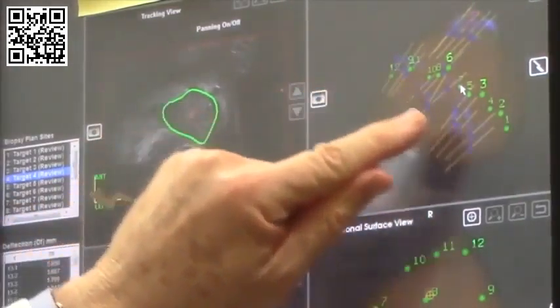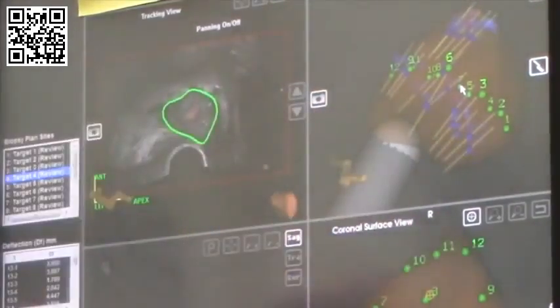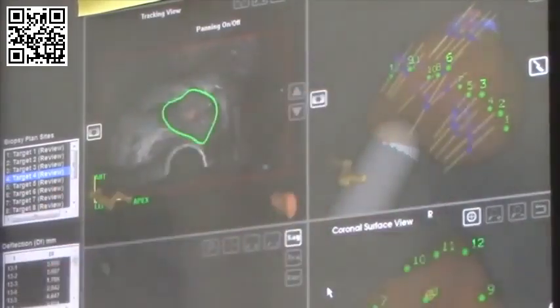These cores here, each tan line represents a biopsy core. These cores represent the conventional catchment of an ultrasound guided biopsy. However, as you can see, this part of the prostate is outside the normal catchment. And this would have been undetected, and in fact was undetected on a prior biopsy. And the MRI allowed us to see this, bring it into the fused model, and obtain targeted prostate biopsies.